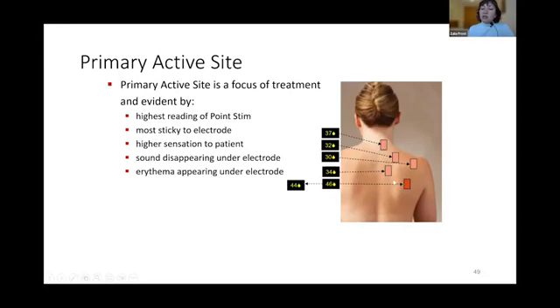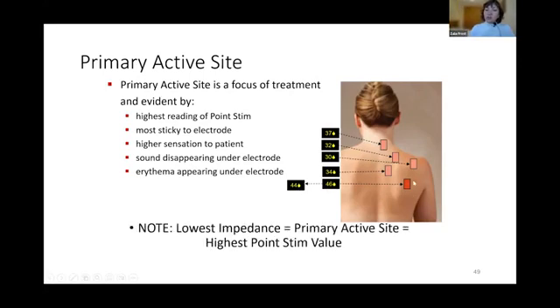But after dynamic treatment, if I retake this number, I place it again and read, typically it goes down, okay? That means the body is already saturated with energy, the charge is there, so the number shows us down. Very occasionally you can see the number keep growing up again, so just carry on working on this point. So this is your primary active site. That's your search. You of course treat all other points, but this is the focus of your attention. This is the best point for treatment.